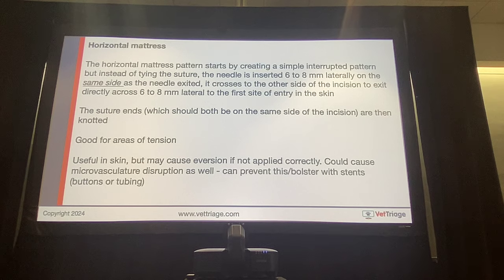And the reason why you don't like that is because the part that's popping up is the internal tissues that are going to get desiccated because now they're exposed to the environment. They're going to dry up, it's going to form scabs, so it hurts the cosmetics of the incision. It takes longer for the incision to heal because it has to form a scab, and the scab exfoliates and it forms a new scab.